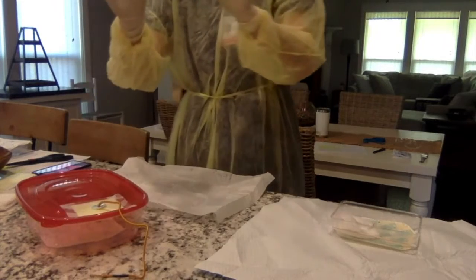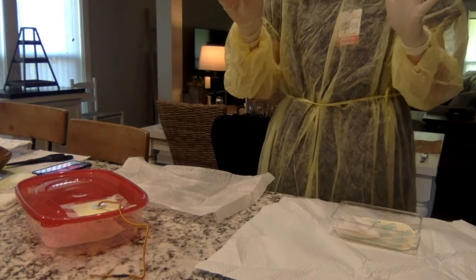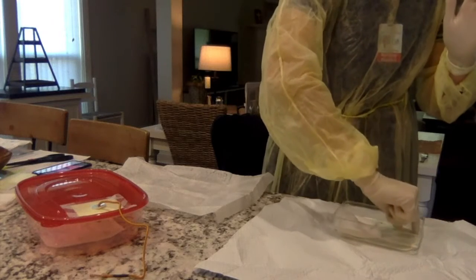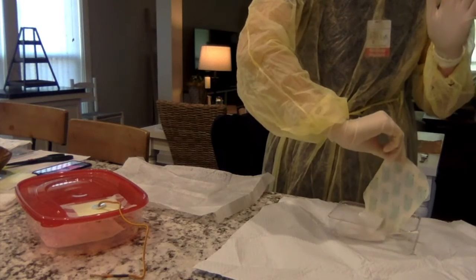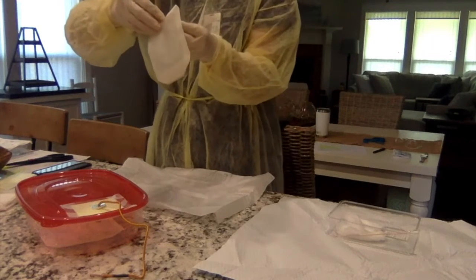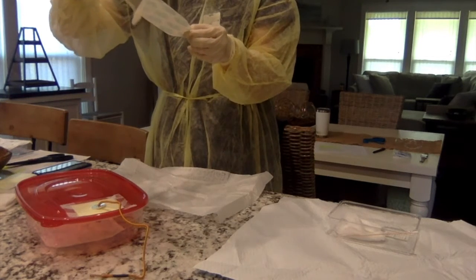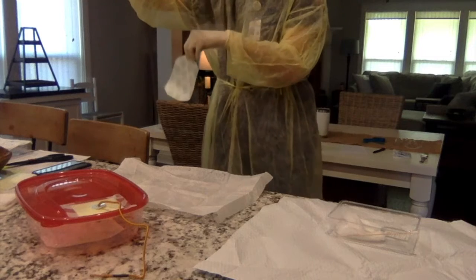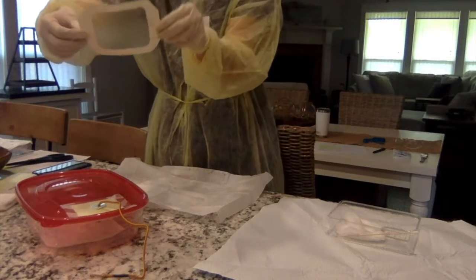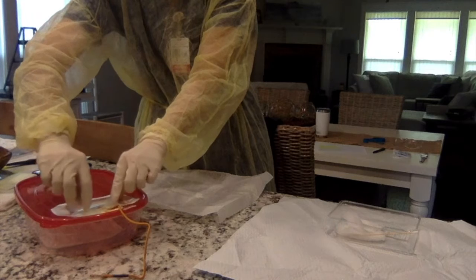So now that I have placed my bio patch, I'm going to take my Tegaderm, and I'm going to use my non-sterile contaminated hand, but I'm not going to touch anything that is sterile on the Tegaderm. Now I'm going to take my Tegaderm and I'm going to open it up. And I'm going to place it over the wound site. I'm going to make sure that it is tight and secured on there with no creasing.